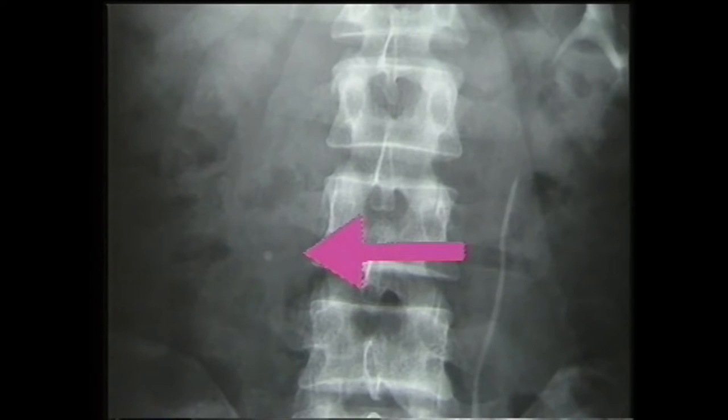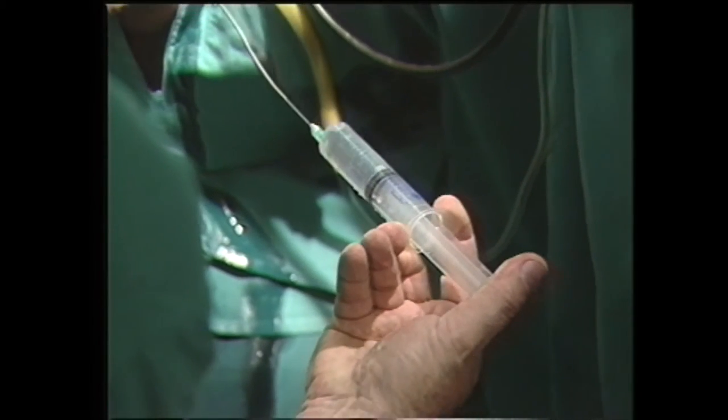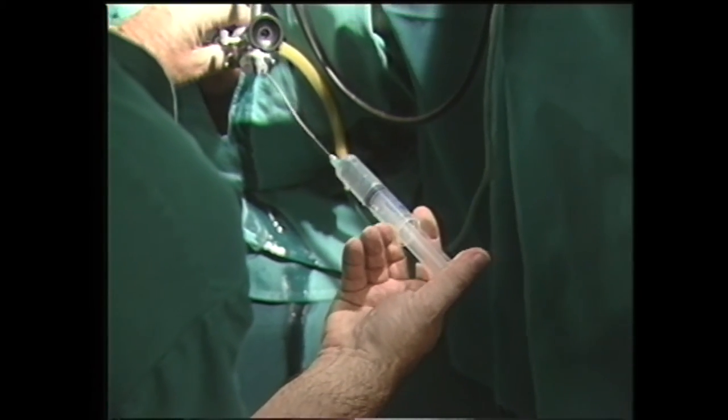Cette urographie montre la présence d'un calcul très douloureux et obstructif du haut uretère droit. L'ultrasonographie ne permettant pas le repérage des calculs dans l'uretère, nous devons mettre en place une sonde urétérale afin de le repousser dans le rein. Une chasse hydrique efficace pratiquée par l'intermédiaire d'une sonde urétérale mise en place par voie endoscopique permet en général de repousser la pierre dans le rein.